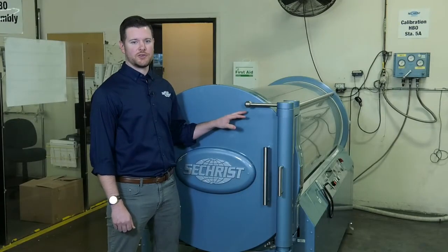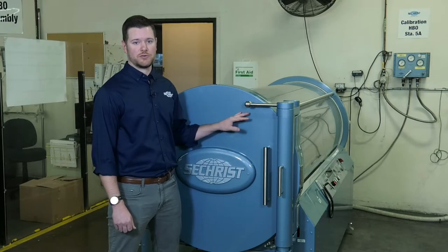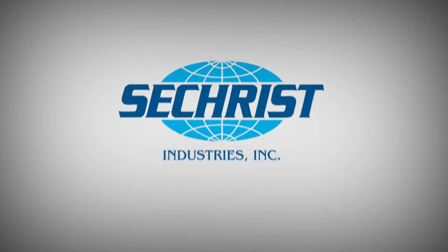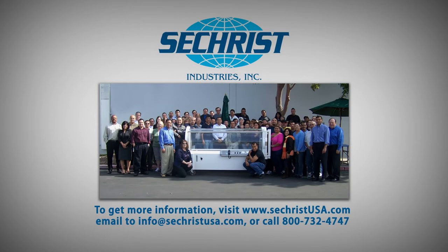Once you've replaced your door seal, you want to pressurize the chamber to 30 psi and make sure you don't have any leaks. If you don't have any leaks, you're finished. And those are the simple steps to replace your door seal. To find out more about any of our full suite of hyperbaric products, please visit us on the web at www.secristusa.com. Our team is standing by to serve you.